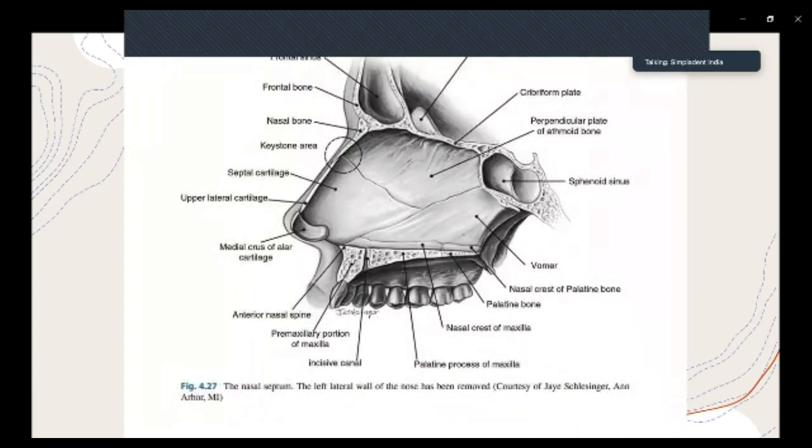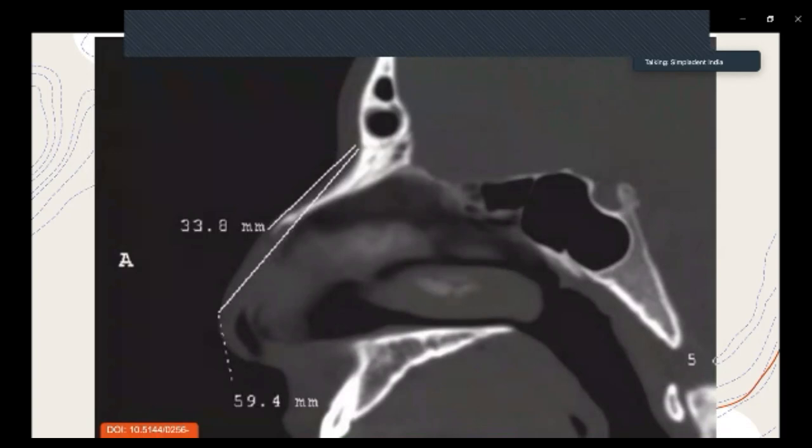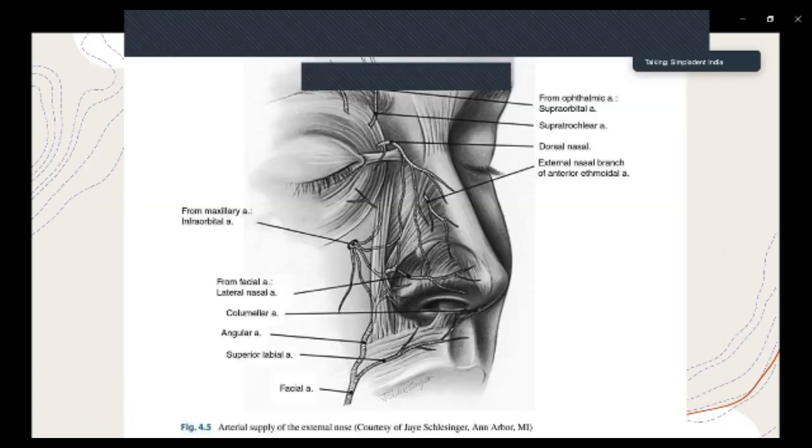So all this has to be taken into consideration. That's the anatomy of the nasal bone and frontal bone. That's the ideal site, the most predictable and minimized-risk site for the glabella implant. Some of the pictures.